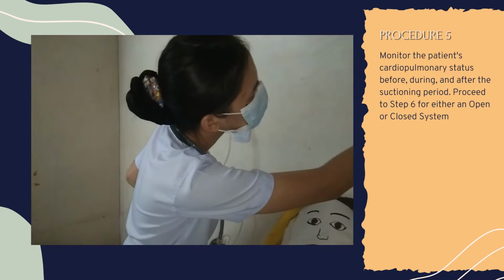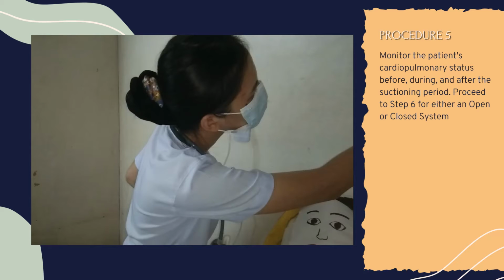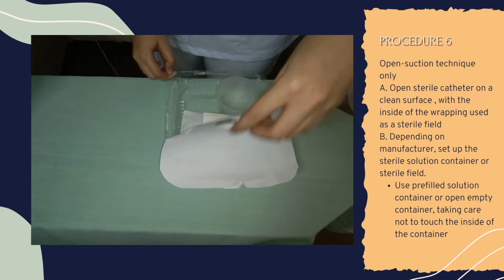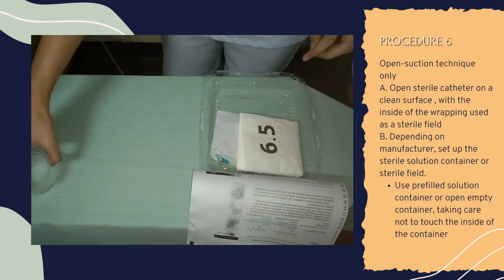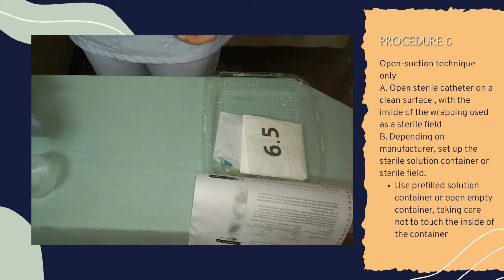Monitor the patient's cardiopulmonary status before, during, and after the suctioning period, and then proceed to step 6 for either an open or closed system. This identifies the signs and symptoms of complications, increased blood pressure, bronchospasms, cardiac dysrhythmias, and more. In open suction technique only, open sterile catheter package on a clean surface with the inside of the wrapping used as a sterile field if present. This prepares the catheter and prevents transmission of microorganisms.